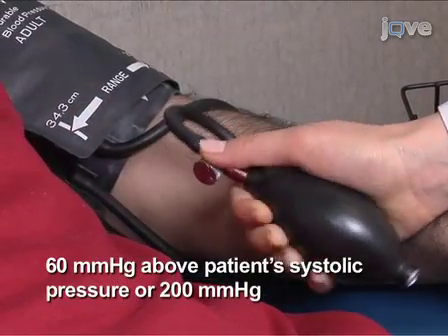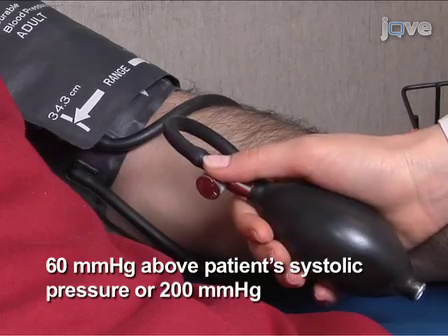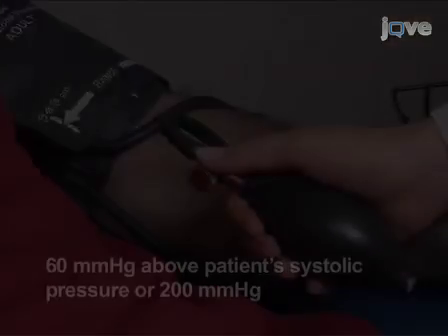Restart the stopwatch, then quickly inflate the cuff pressure to 60 millimeters of mercury above the patient's systolic pressure, or 200 millimeters of mercury, whichever is higher.